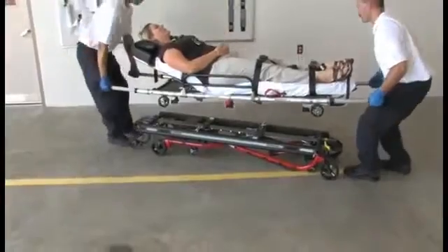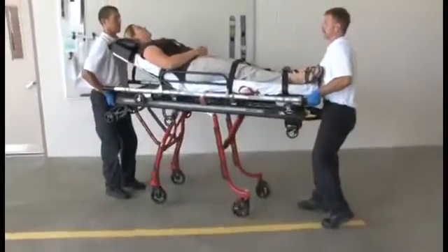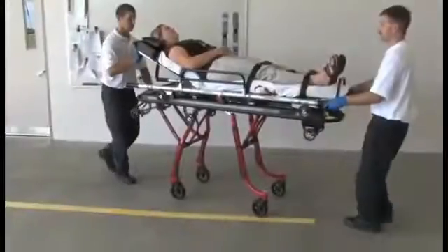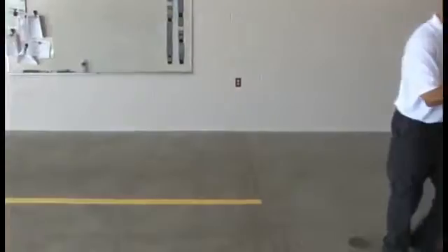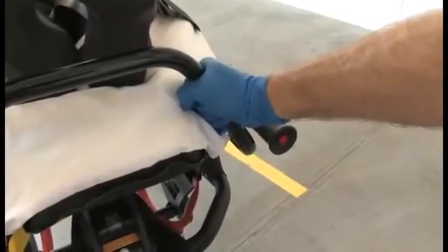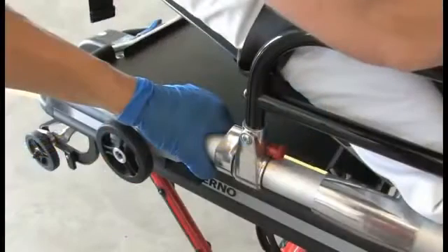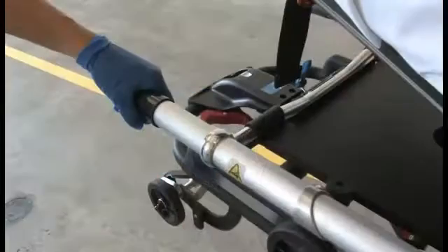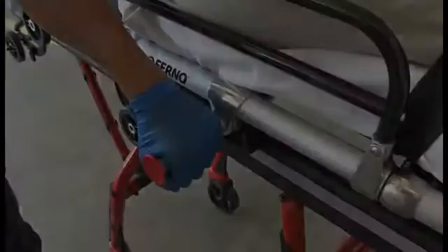You may now place the stretcher onto the transporter if needed. Raise the transporter to a rolling position and roll the cot. To roll the cot when you are the control end operator, pull the cot by grasping the stretcher foot handle or pull-out handles. When you are the assisting operator, pull or push by grasping the mainframe at the center of the cot, at the load end of the cot, or by using the pull-out handles.